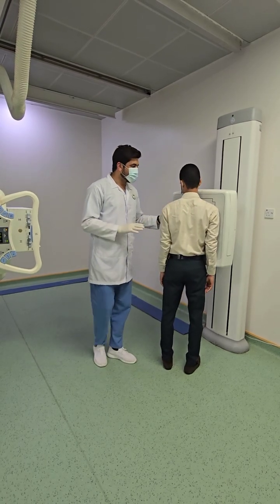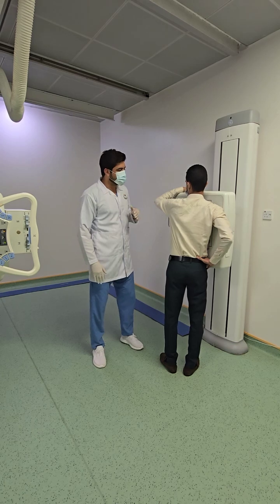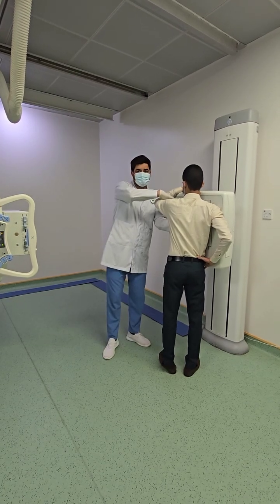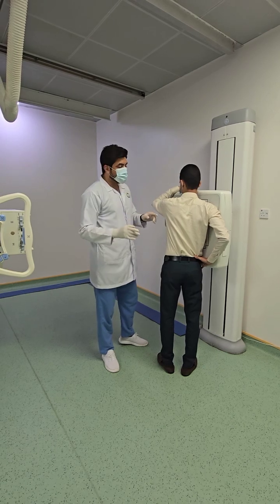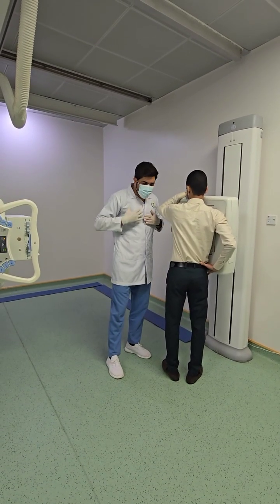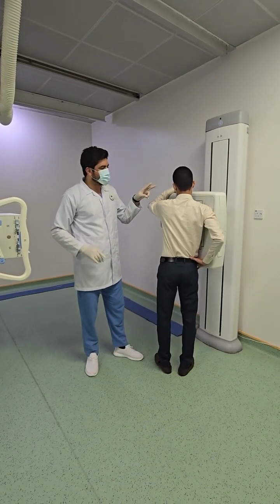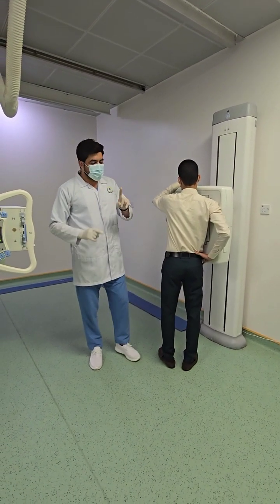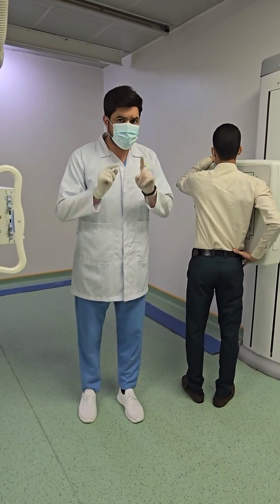Now, which part of the body of the patient is near to the detector? The anterior side. This is the anterior side of the body because the posterior side is near to the X-ray tube. But in the oblique position, we will take the body side which is near to the receptor or the detector. So the body is now in the anterior oblique. One is anterior oblique, the other is posterior oblique. Now I will cover the anterior oblique.